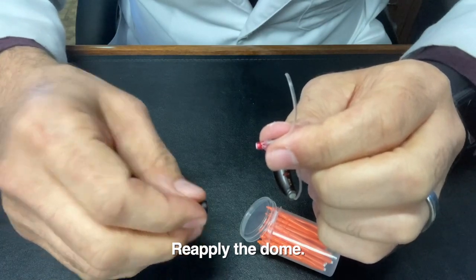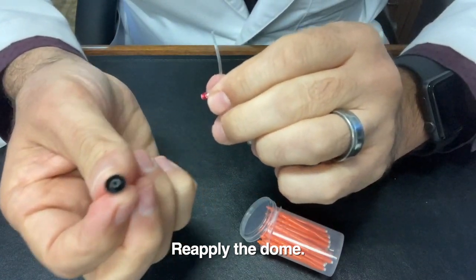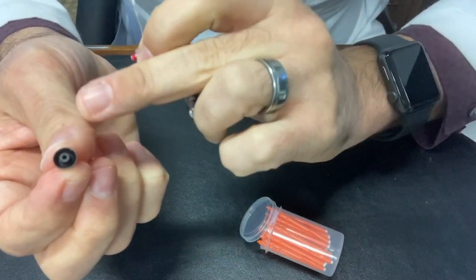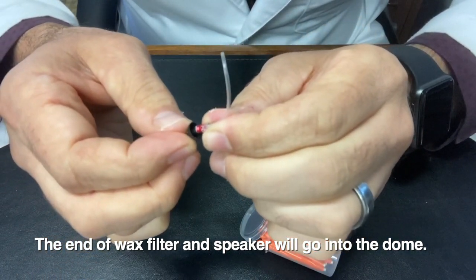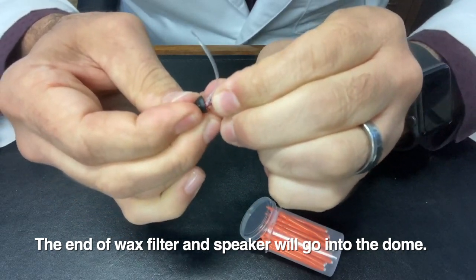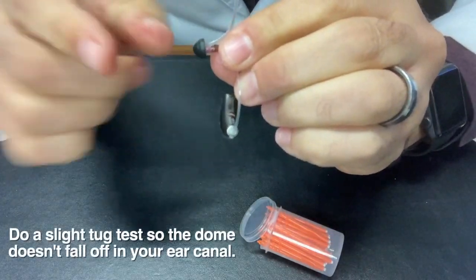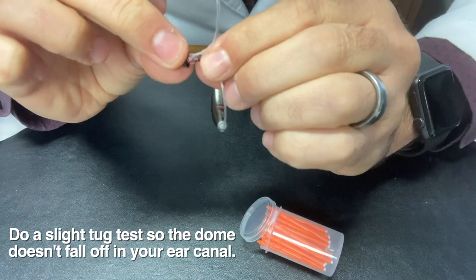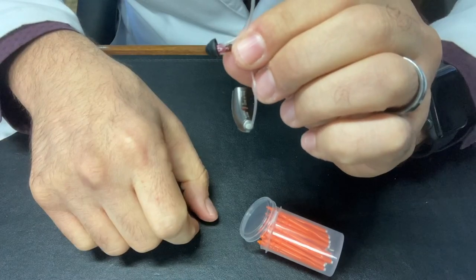The next thing we'll do is take the dome, and we want to hold it so that we can see the underside of it. Can you see that grommet there? The end of this is going to go directly back into that grommet. So what we'll do is line this up, and you're just going to wedge it right onto there. If you've wedged it on correctly, you should be able to give a slight tug just to make sure that it's not going to pop off into your ear canal. You want to make sure that that's on nice and firm.